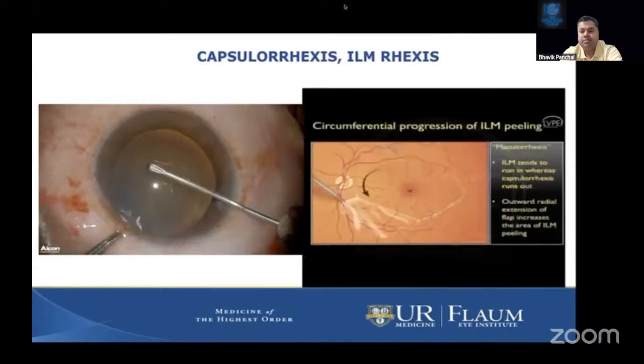It's easier to learn ILM peeling by just changing the terminology to ILM folding, so you know where to pull the tissue or in which direction to pull the ILM, because sometimes fellows can be confused as to which direction they should pull. So just simply fold the ILM once you break it and it will get peeled.